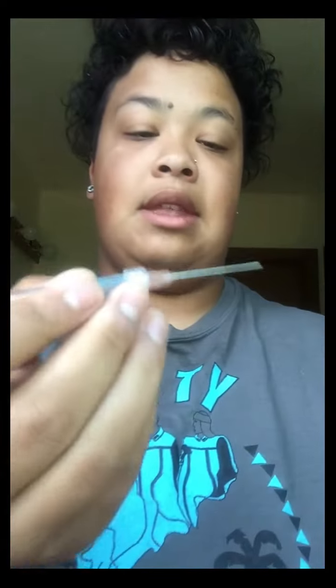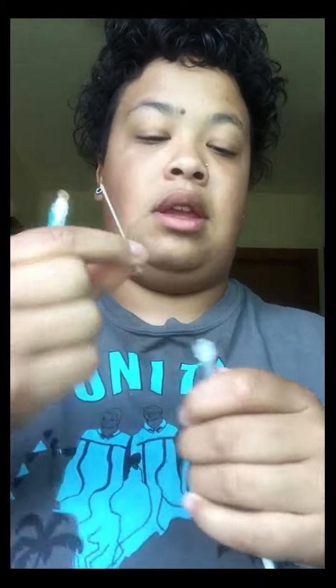Bring it back to your dose. Flip it upside down and that's that. The next part — what I do is I twist this off really carefully and I put the cap back on it. Actually you're supposed to put the cap on before, but I just forgot to do it, so hopefully my doctor doesn't see this.